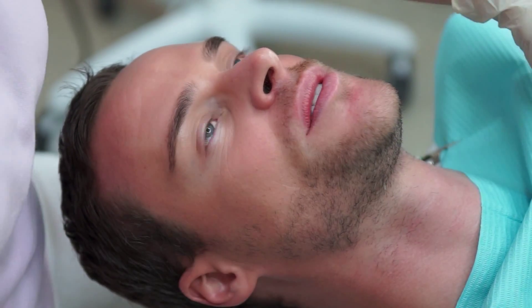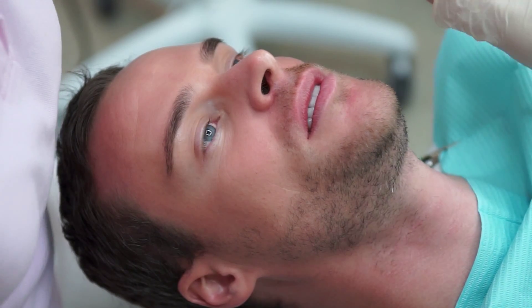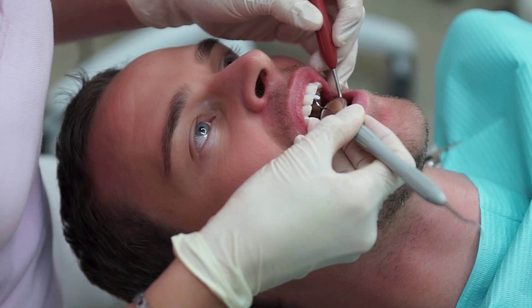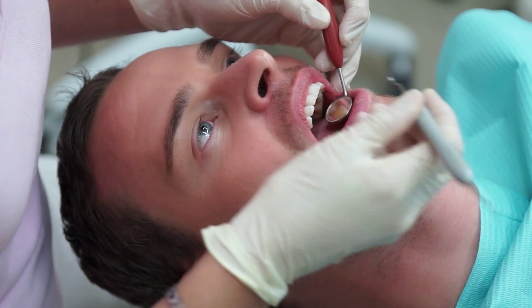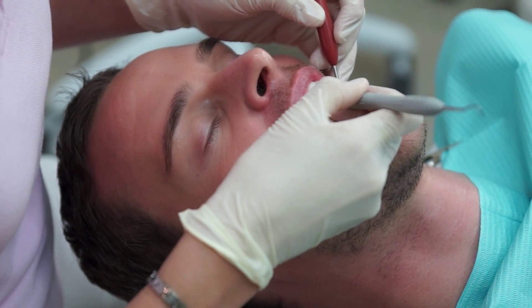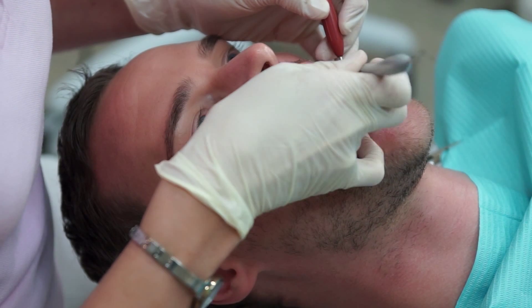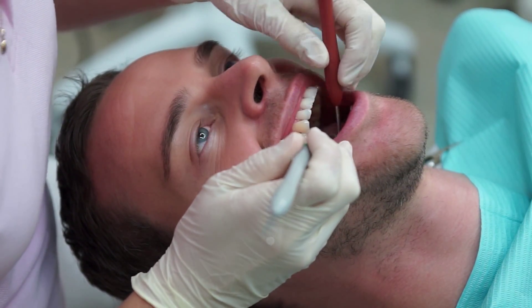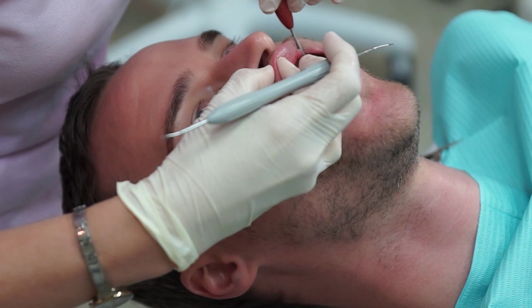The dental hygienist will make sure that no excess material is lying anywhere on the outside, inside, or in between the teeth. He will properly examine all the soft tissue to make sure that no irritable damage has been done to them while doing the procedure.